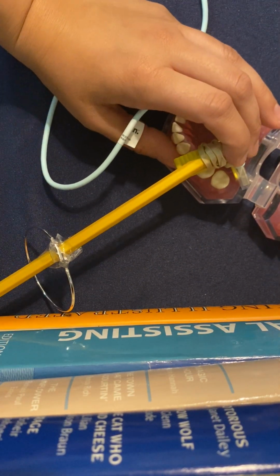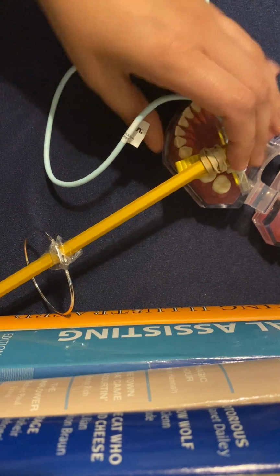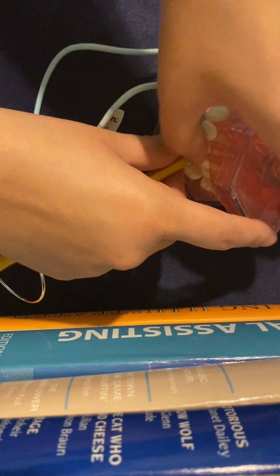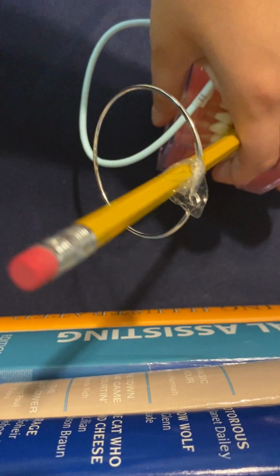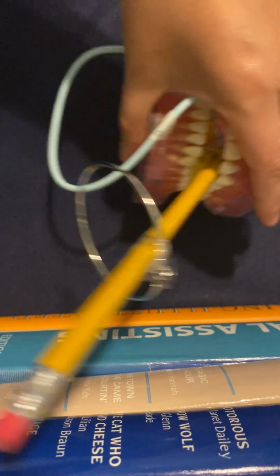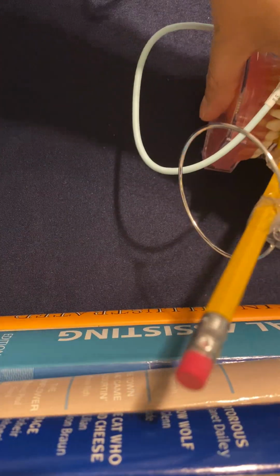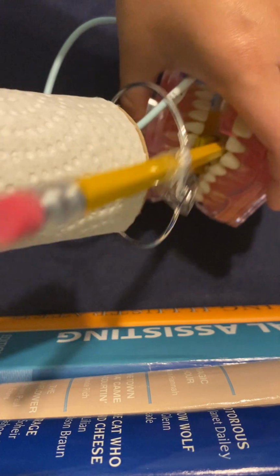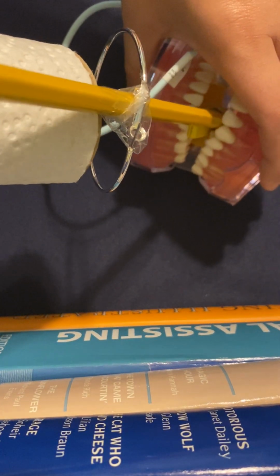And the teeth that you're going to want to see are the distal of the canine, first and second premolar, and the first molar, crown, and apices. So you're going to hold that down, and then you're going to point down from the pupil to the mid-mandibular area. So he's biting down on that. There's your little positioning one. Point down very much like so, and line it up with the XCP.